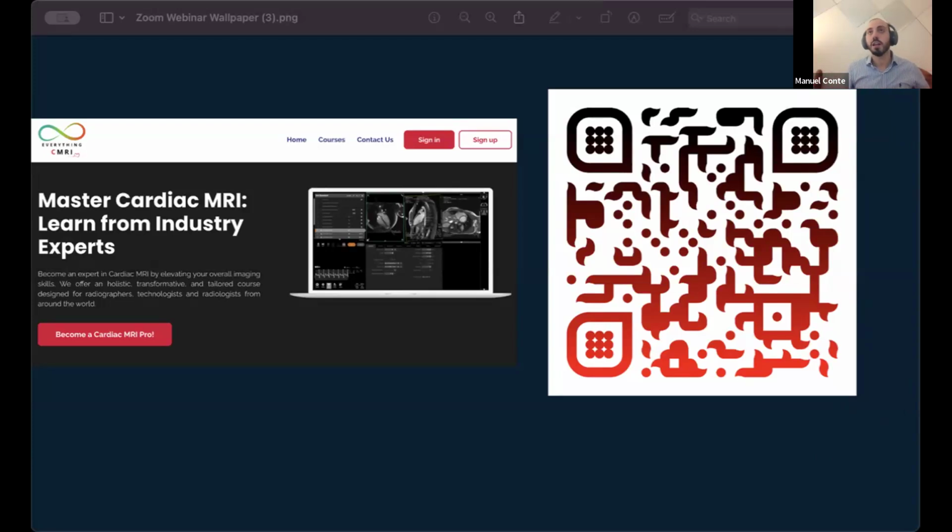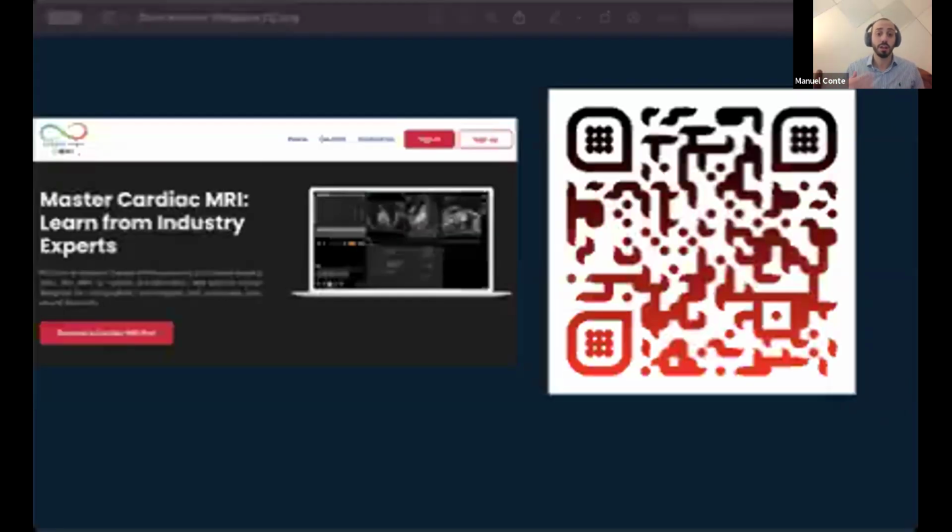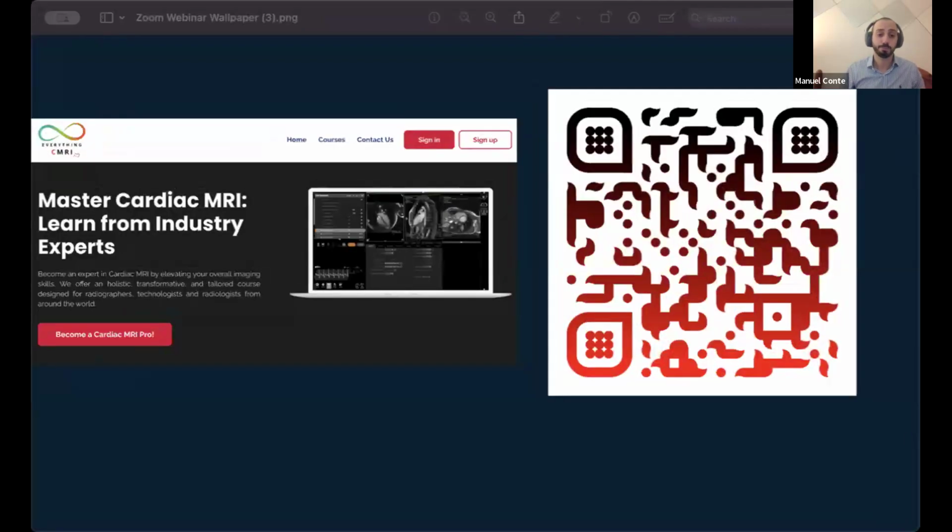And then you can give more signal, maybe by increasing the averages, increasing the oversampling. Even if you increase the FOV, you give more signal. So you can use all these techniques to give more signal to the image. But yes, the average is the main one. Normally, if I have one average and I increase the bandwidth, I can use 3 averages and use GRAPPA, for example.